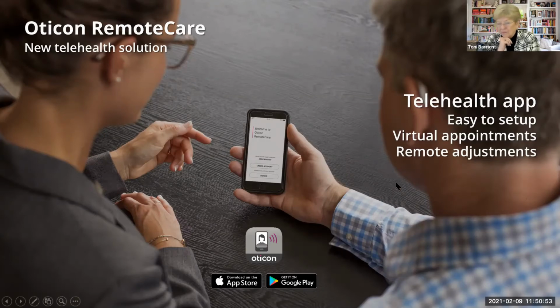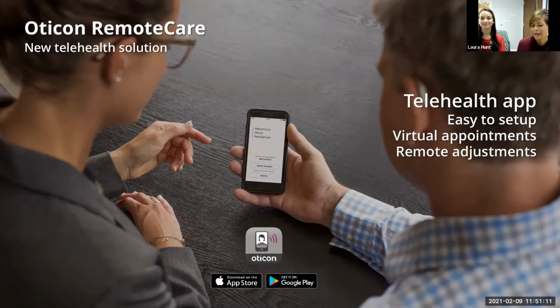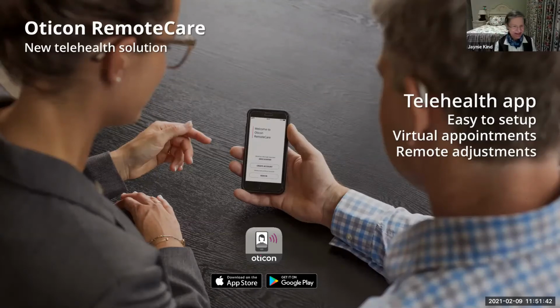Janie, would you like to unmute yourself and ask your question? Sure. I just bought Oticon Exceed hearing aid, Oticon Exceed 2. Mm-hmm. And will the RemoteCare work for those? You mentioned the model. Yes. Yeah, great. So the Exceed is just the behind the ear version, but it uses the ON app, and yes, you would be able to do the RemoteCare with that hearing aid for sure. Yep. Now you got to make sure that your hearing healthcare provider is doing it on their end, but if they're not, we would be happy to help you. Thank you.